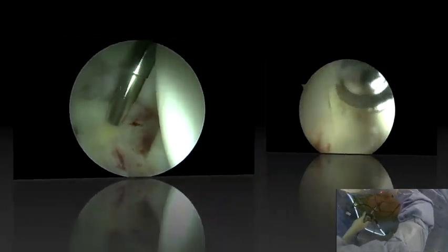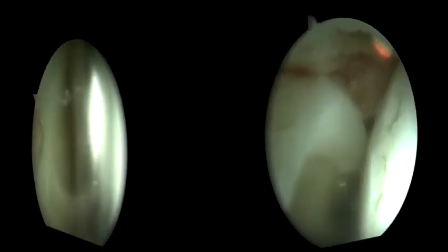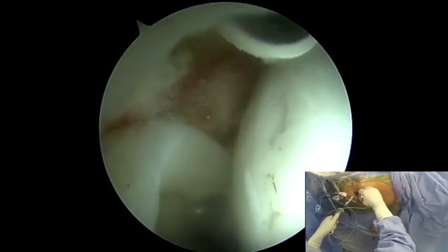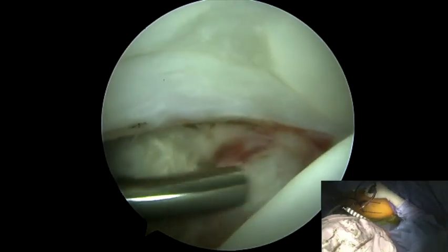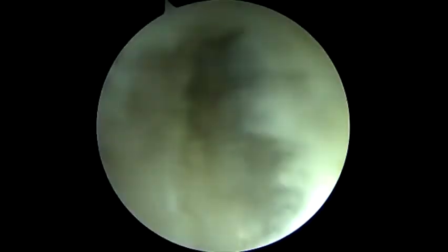After diagnostic arthroscopy is performed, an irrigation and debridement of purulence and a synovectomy is performed using a mix of shaver and radiofrequency ablator device. Once a thorough debridement of all infected tissue is completed and a minimum of 6 liters of irrigation fluid is run through the joint, traction is let down on the hip and the femoral head is reduced, and the suction seal effect of the labrum is observed to be maintained.